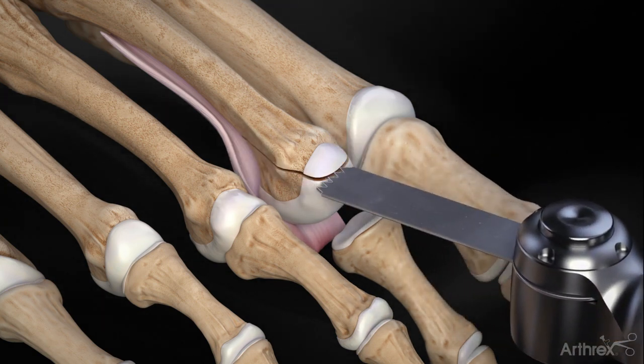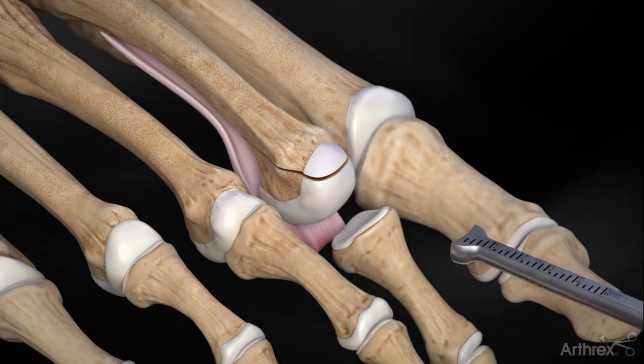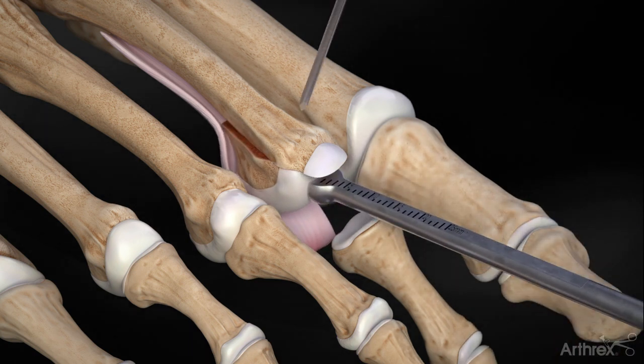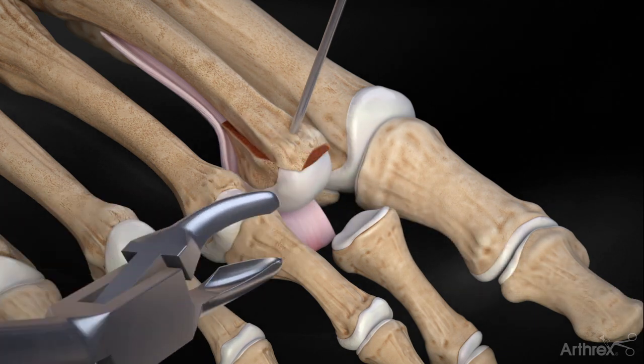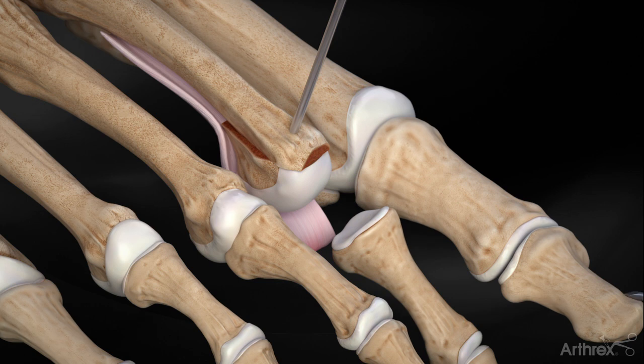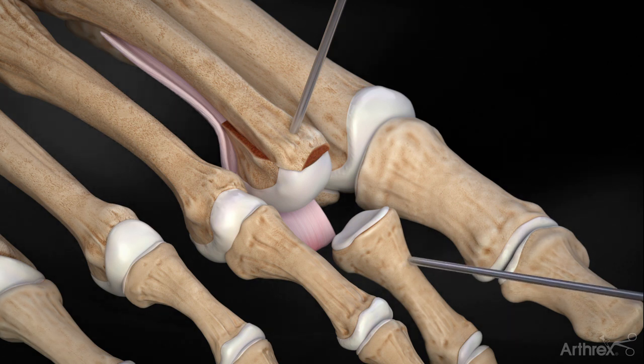Shift the metatarsal proximally and fixate utilizing a K-wire. Using a small rongeur, remove the dorsal overhang of the metatarsal. The first K-wire is inserted into the proximal phalanx. Next, insert the second K-wire into the metatarsal at least 5 mm proximal to the K-wire holding the metatarsal osteotomy.